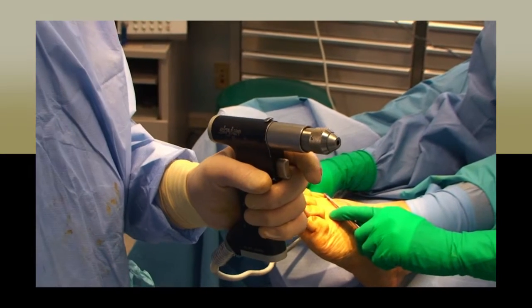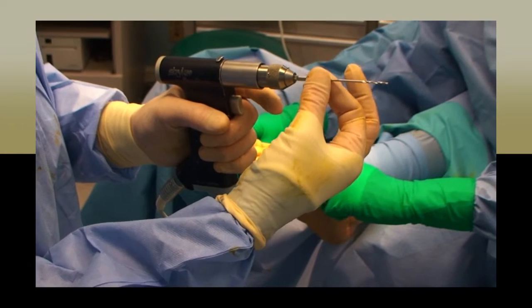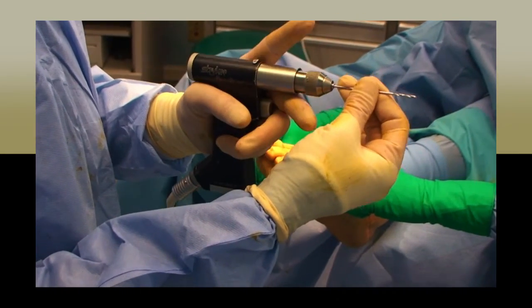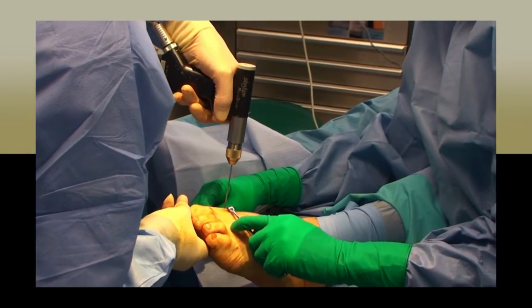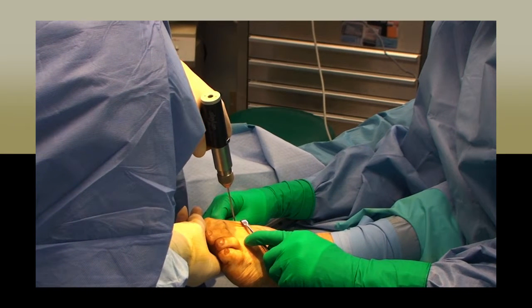Once this locks in place, you may now place the drill bits on the head. To do so, you'll need to follow the direction of the surgeon, as he will know which size bit to use and how. When placing a bit, push the guide at the head of the drill forward. This opens a slot, allowing the bit to slide down into the top of the head. Releasing the guide will lock the bit into place. The drill will then be used to make the guide holes and prepare the bone to receive a screw, but the initial threading and then subsequent planting of the screw will be done by hand using the screwdriver.